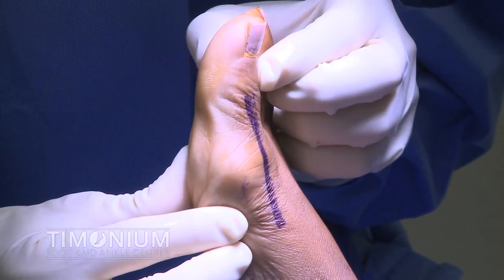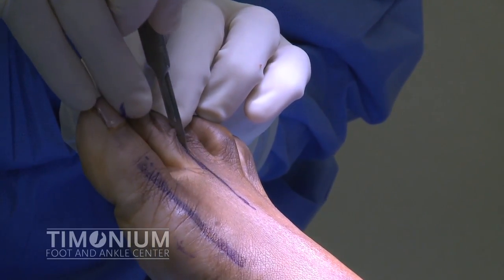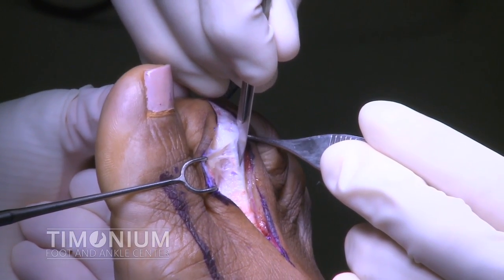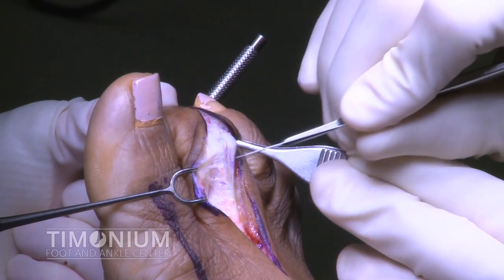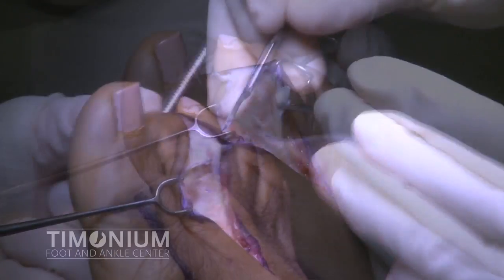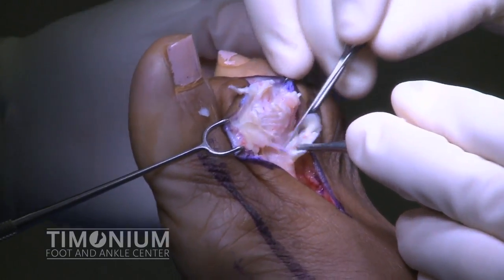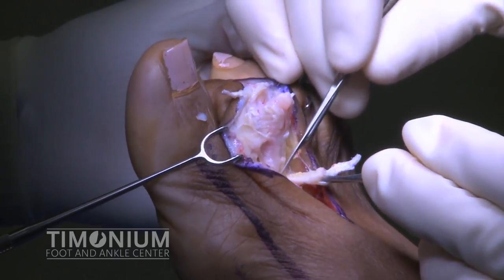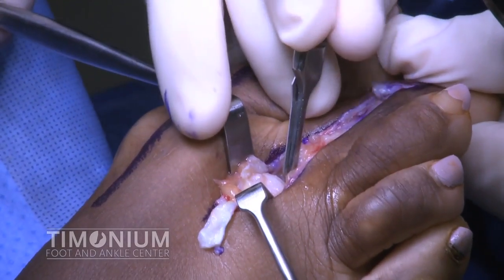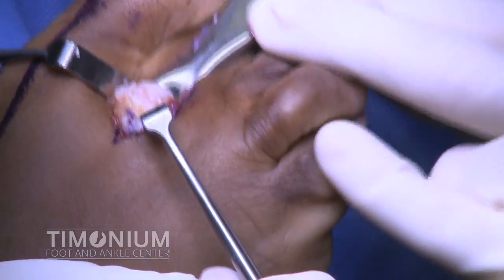Here we can see the patient's limited range of motion at the big toe joint as a result of arthritis. The second toe procedure is started with a skin incision taken down to the subcutaneous tissue. The proximal interphalangeal joint of the second toe is identified and the extensor tendon is transected in a Z fashion. The tendon is then reflected back proximally to the level of the second metatarsophalangeal joint. The collateral ligaments are transected at the second metatarsophalangeal joint.